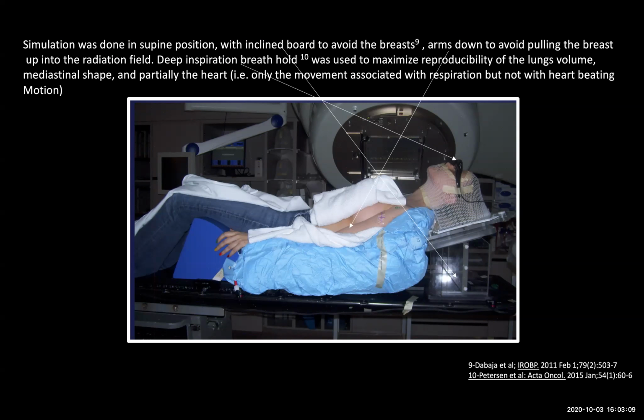So to sum it up, you put the inclined board to benefit the breasts, but then there are implications of having the inclined board. One, the mandible becomes closer to the entrance of the AP beam, and two, the gantry might collide with the posterior beam. Therefore, to mitigate that, you put a mask to elevate the mandible and hyperextend the neck, and you put the isocenter as posterior as possible, not to collide with the table.